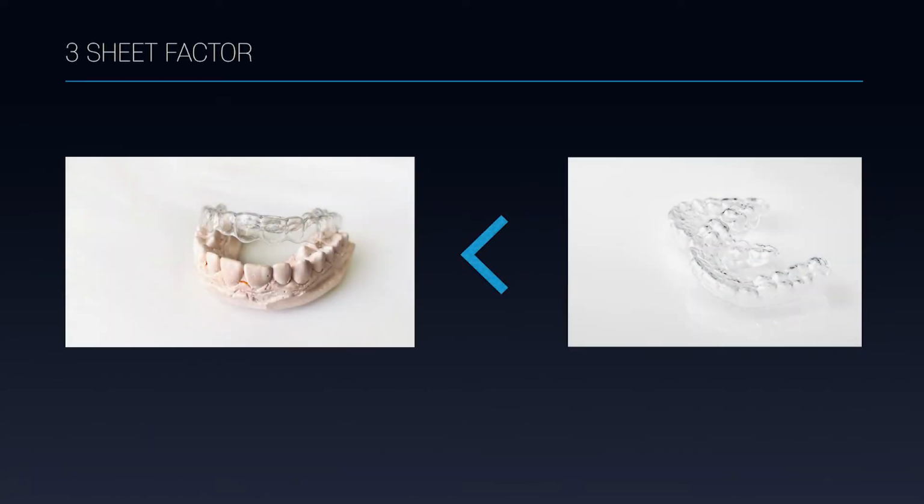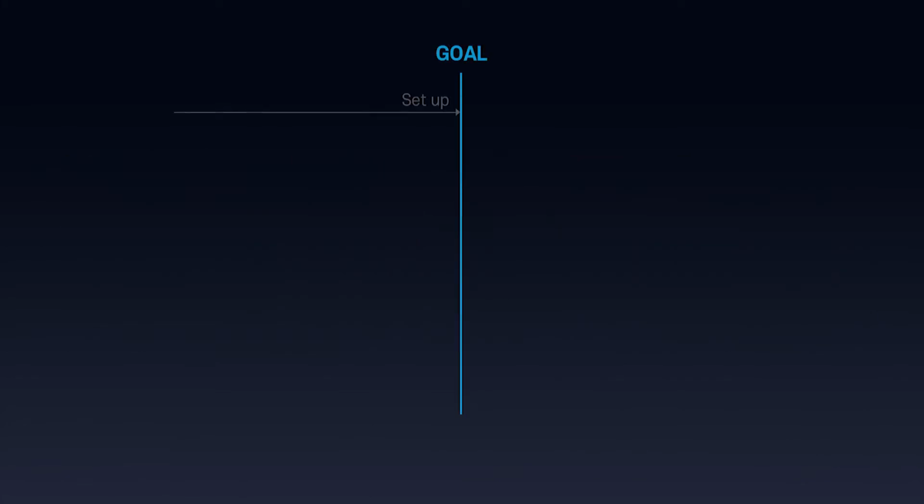The sheet also affects the success rate of the setup. Clear aligners that cover the whole gingiva with the marginal line have a higher anchorage effect than clear aligners that cover only the crown. By applying overcorrection, the treatment proceeds by giving a movement amount higher than the target value.